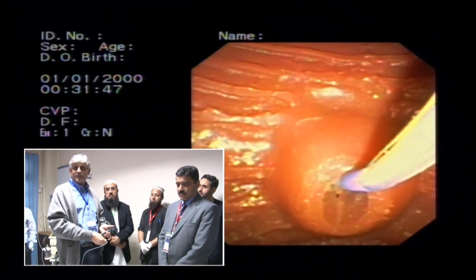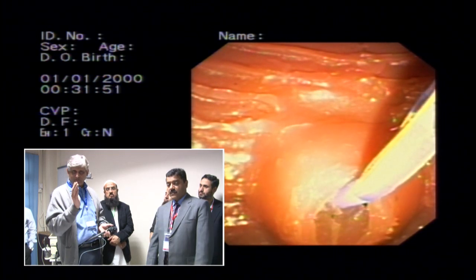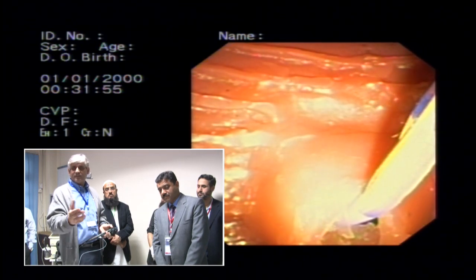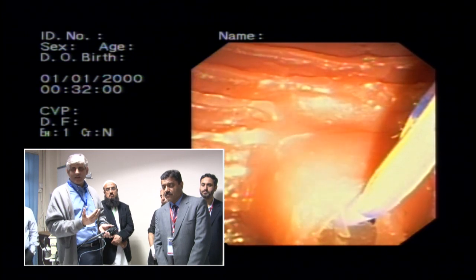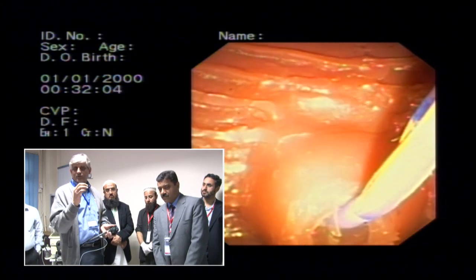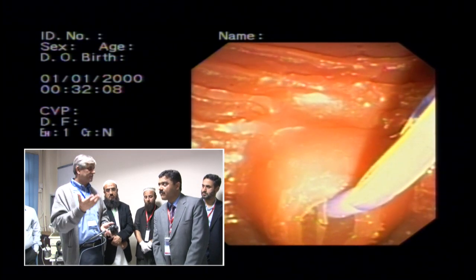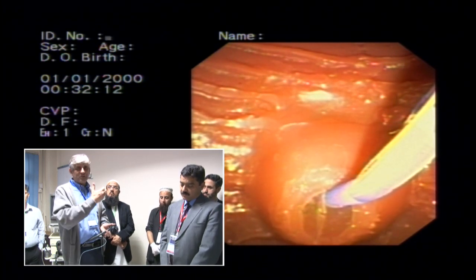Once the wire is in, you take the cannula, put the tip in, use the big wheel, bring your ampulla close again the same way, and ask your technician to push the wire in, advance the wire in. If the wire goes, great. If it doesn't go, then use the bridge. Wire guided done, bridge done.